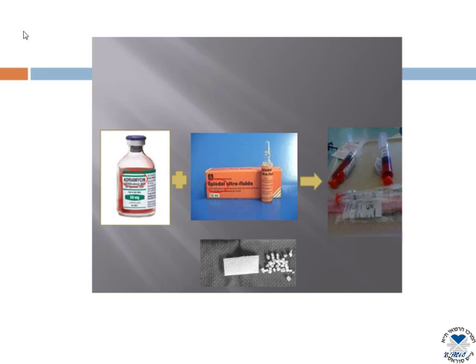This is followed, not always, by an embolizing agent, usually gelfoam pledgets. Usually we cut them to 1 millimeter cubes, but sometimes other embolic agents such as polyvinyl alcohol are used.